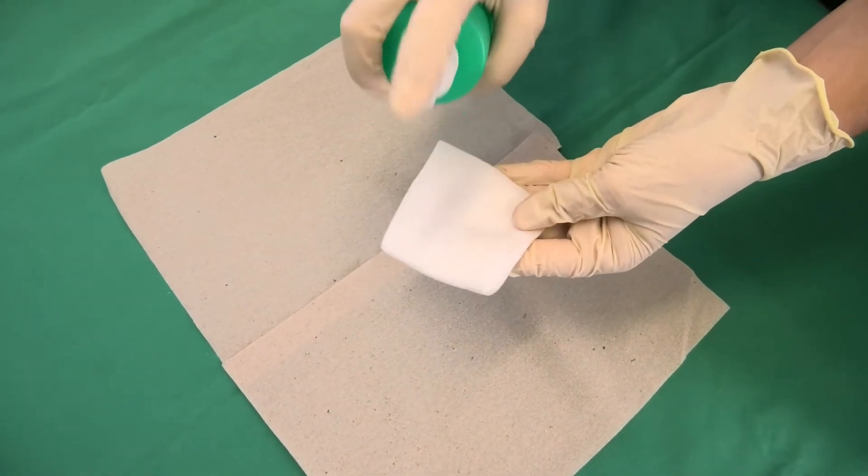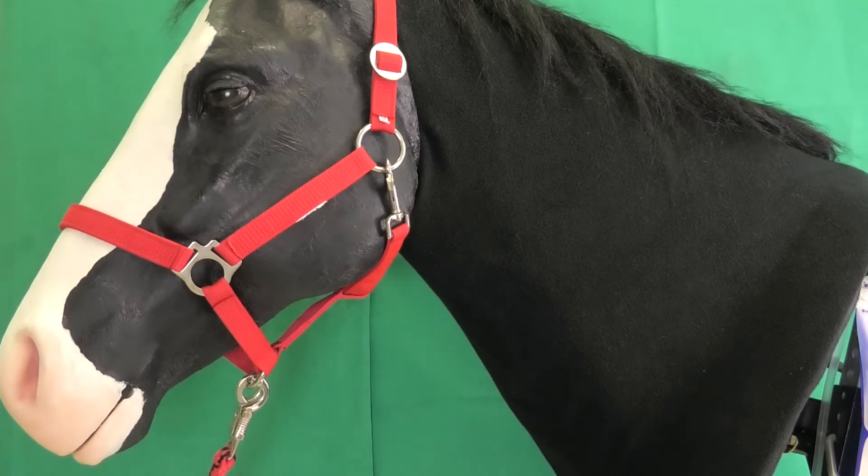The puncture site is then disinfected with a swab soaked in alcohol.